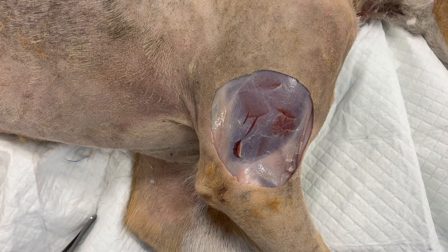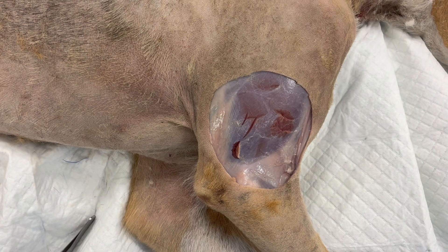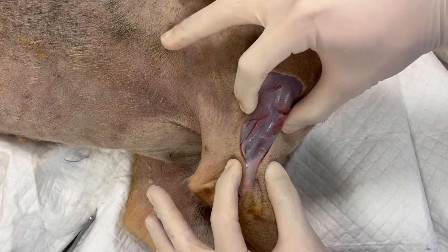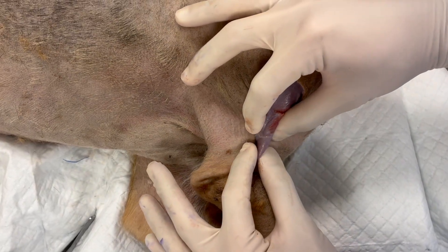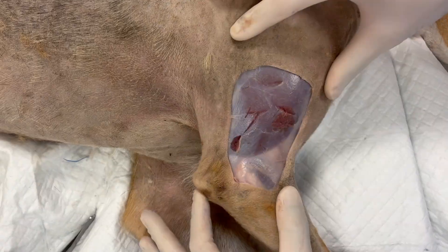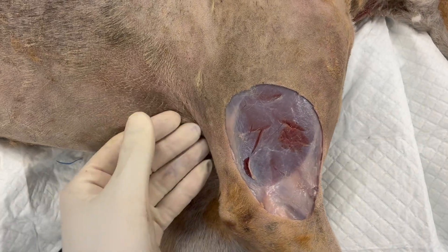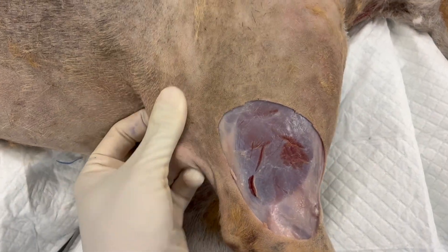This particular procedure is a great example of how the main principle of reconstructive surgery is to take skin where it is abundant and move it into a defect. It was first described by Geraldine Hunt, who reported using the excessive skin of the flank fold and elbow fold to cover large regional defects.